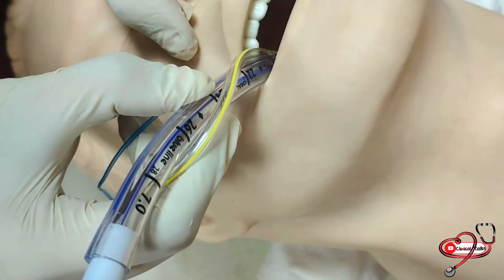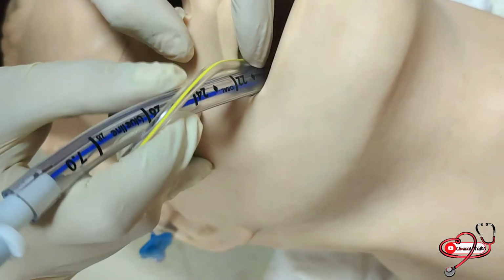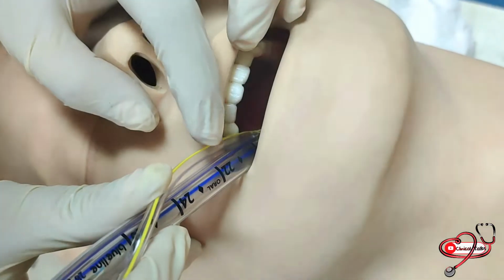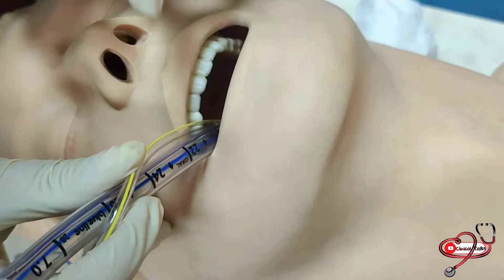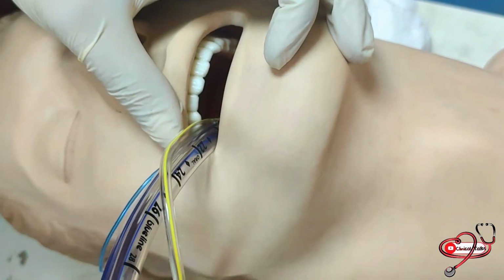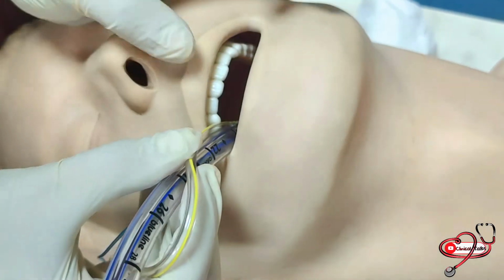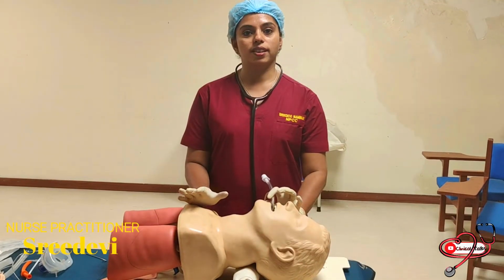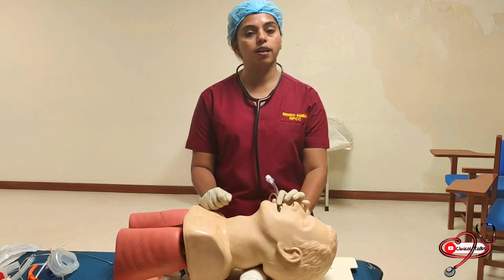On auscultation, if bilateral breath sounds are equal, then you can fix the endotracheal tube and see the lip mark and the number. You should note it down so that later on, if there is any displacement, you will come to know. At the lip level, you need to fix the ET tube with the ET tape, according to the hospital policy, whatever is available, either a belt or a tape, you can use it. After the intubation, you need to order an X-ray to confirm the position of the endotracheal tube.